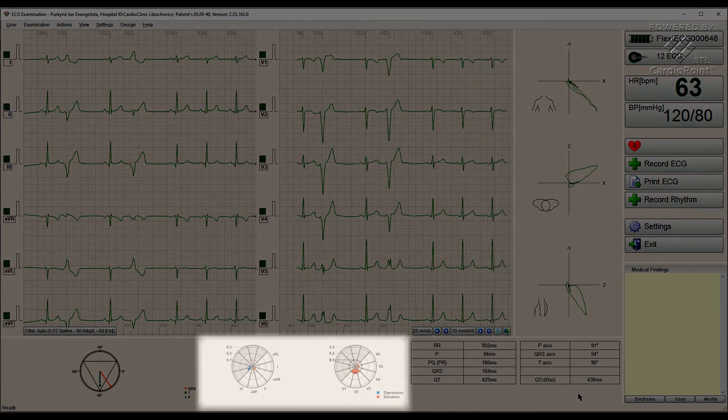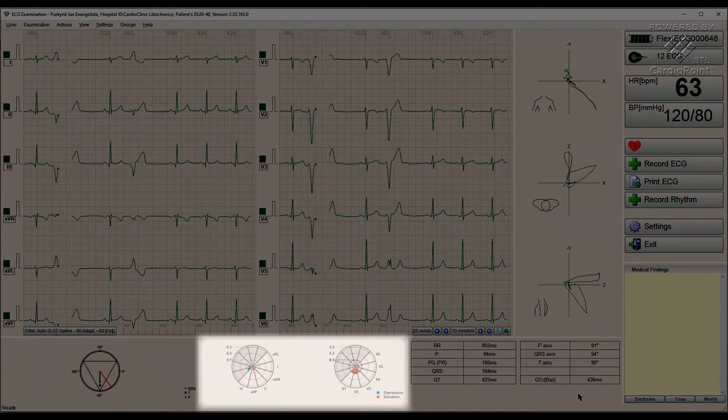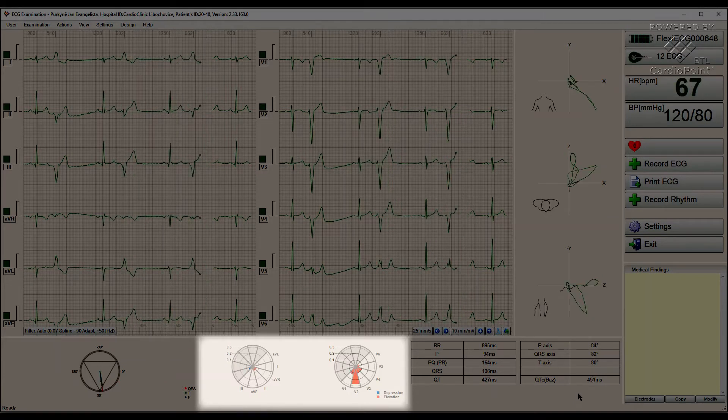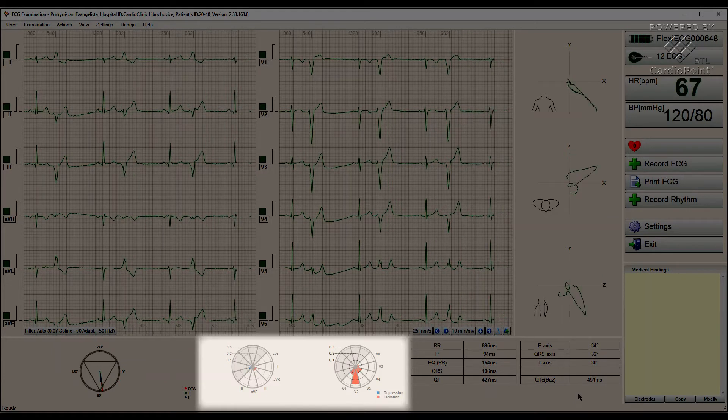ST maps provide a comfortable overview about deviations of the ST segments in all 12 leads at the same time.